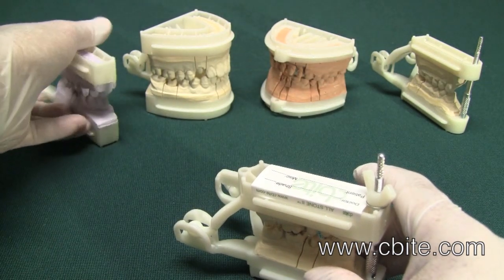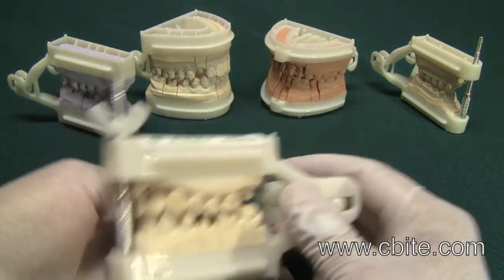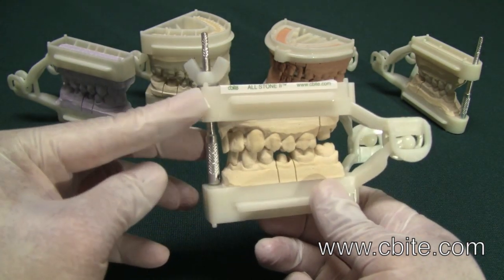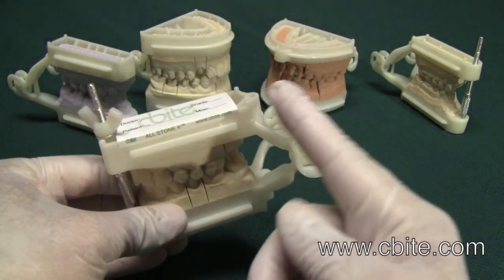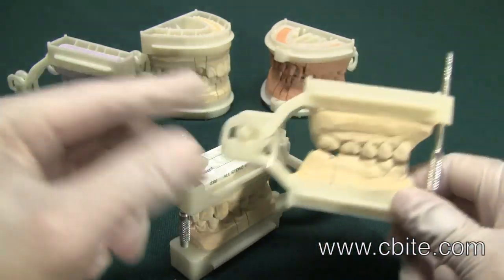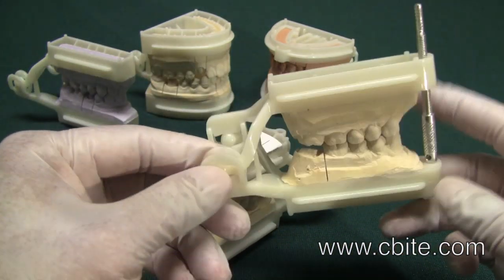Furthermore, we have incorporated the incisal pin which you can use up front and also in the back. In the Allstone 2, you can only use the incisal pin up front.